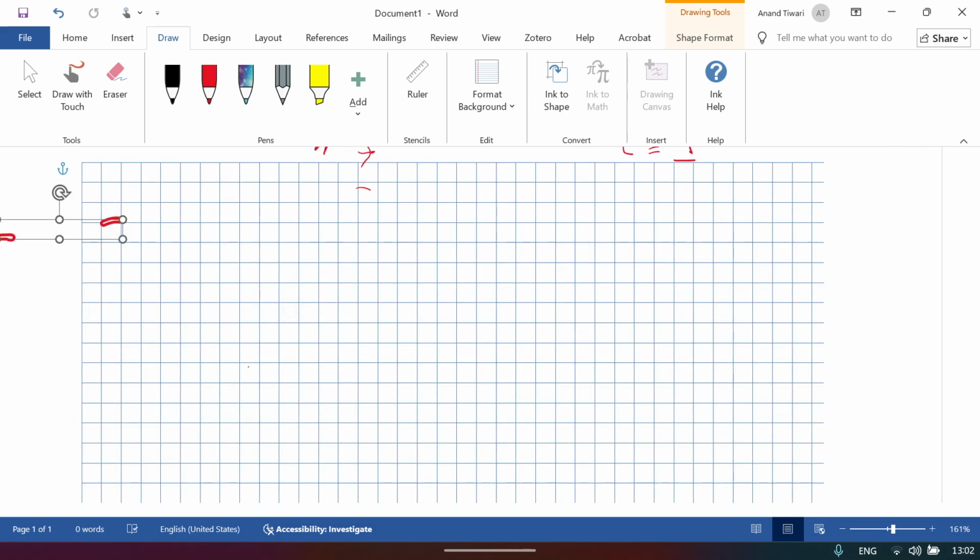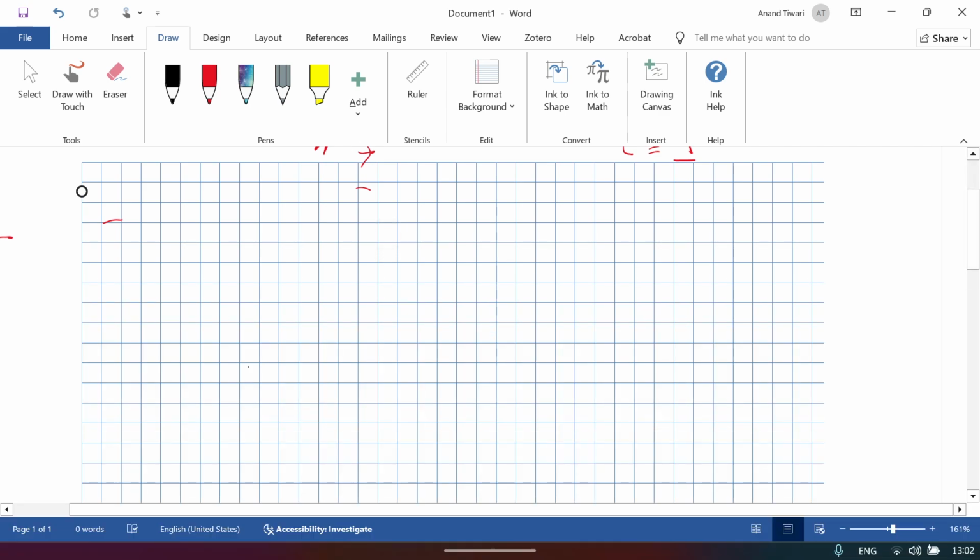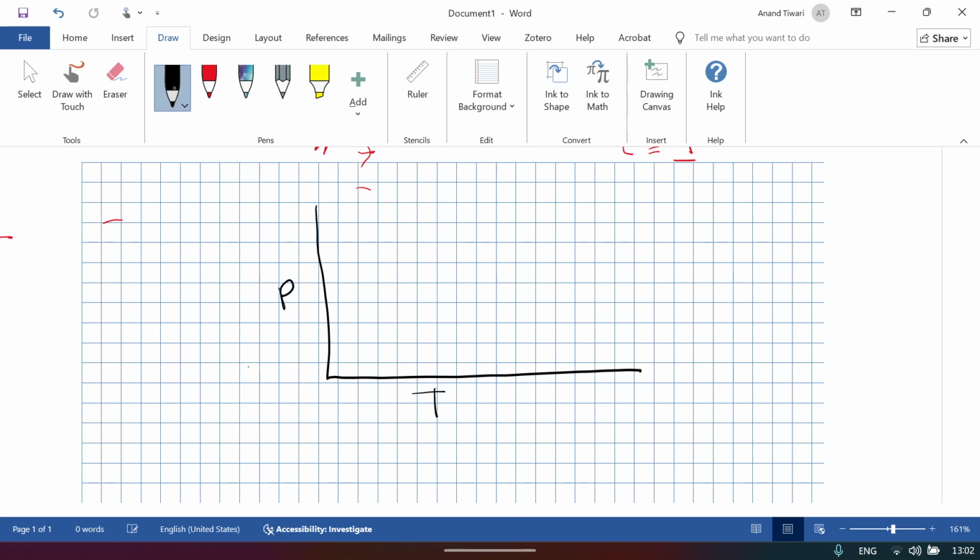What else can we know? If I draw this pressure time curve again, this is pressure, this is time, this goes up, inspiratory pause, plateau pressure. At expiration, I have kept a hold on expiration, and this slowly rises here. So this is my baseline positive end expiratory pressure.